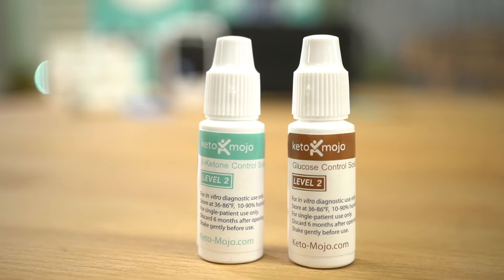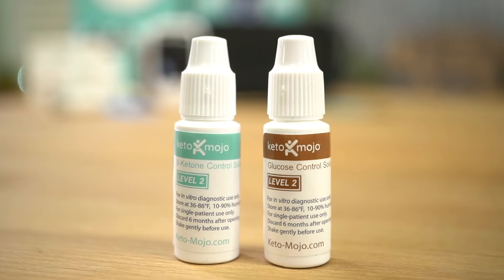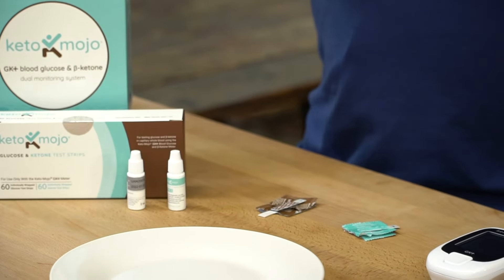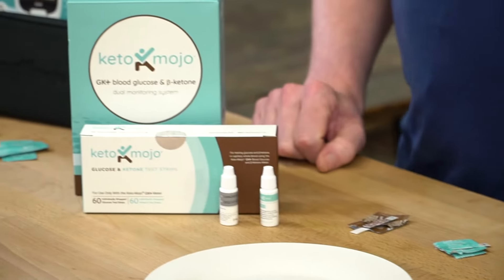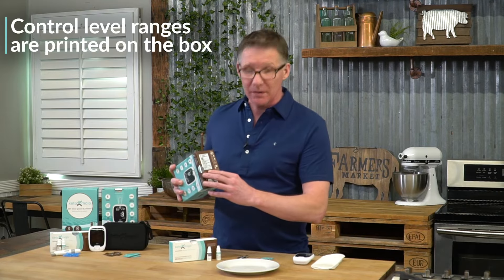We're going to do a control solution test right now. To prepare for your control solution test, you will need your control solutions that come in your kit. You will need a ketone strip and a glucose strip, and you will also need the boxes which the strips came in, because at the bottom they have your control level.